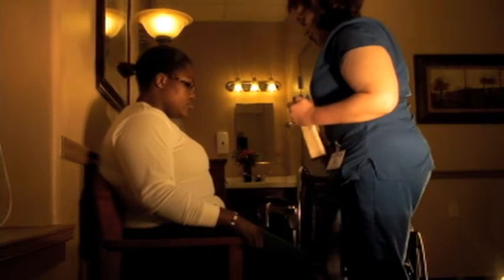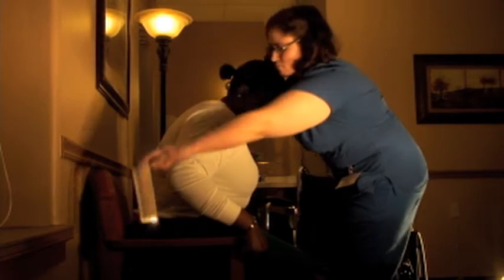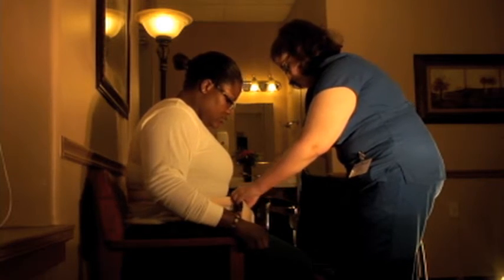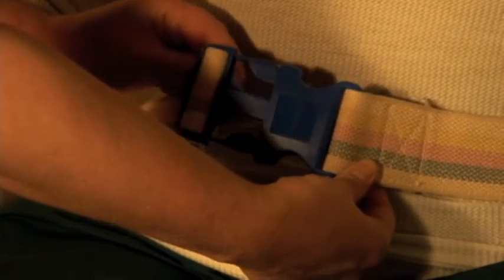To properly use a gate belt, first, ask the resident to scoot forward in a chair or bed in a seated position so the gate belt can be placed around the waist. Make sure the belt is positioned over the clothing and the clip is in front. This will allow for easier belt adjustments and removal.